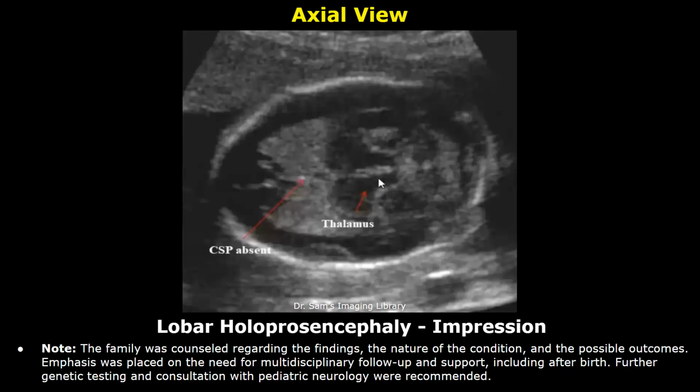Note: the family was counseled regarding the findings, the nature of the condition, and the possible outcomes. Emphasis was placed on the need for multidisciplinary follow-up and support, including after birth. Further genetic testing and consultation with pediatric neurology were recommended.